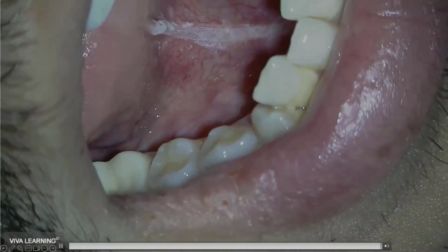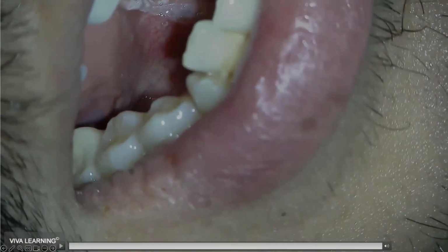Now I believe I added this afternoon an extraction case where I'm going to be elevating root tips. That patient's numb, but I'm using the incredible cutting and post-op healing from the laser to get the job done. So that's a huge part of it.